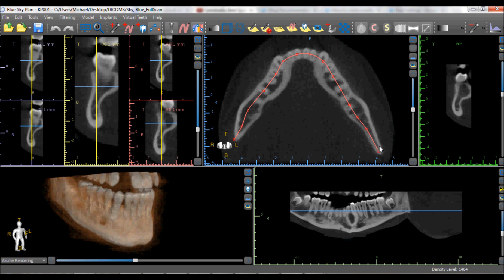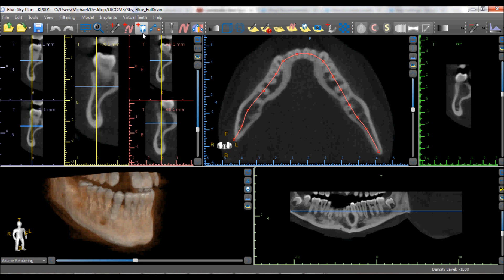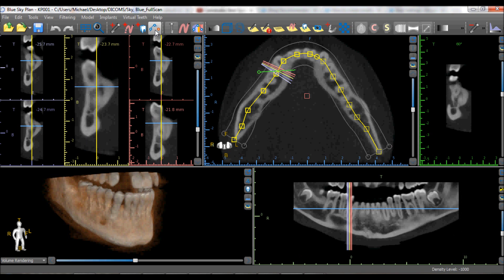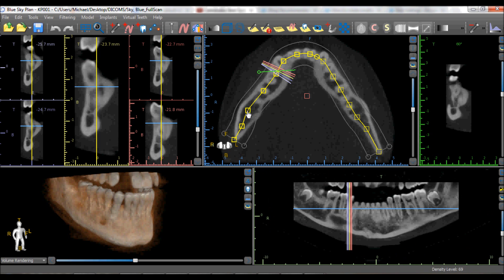Once the curve is complete, the user can once again go to Tools > Edit Curve or click on the Edit Curve icon in the horizontal toolbar. The squares along the panoramic curve can be grabbed and dragged to fine-tune the placement.